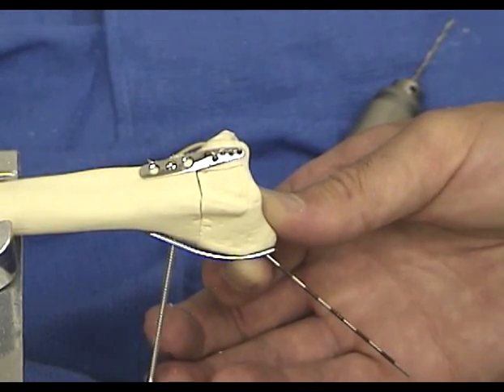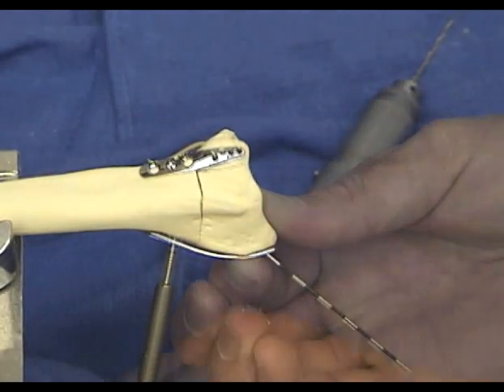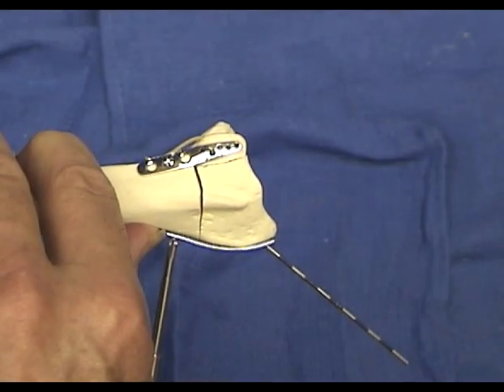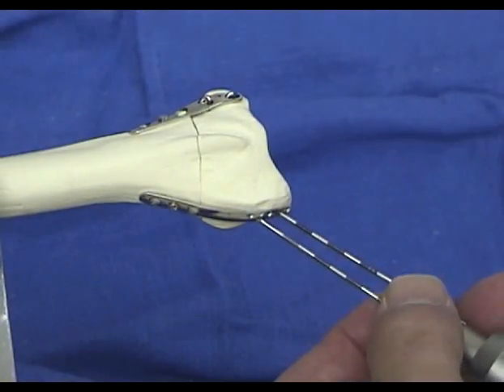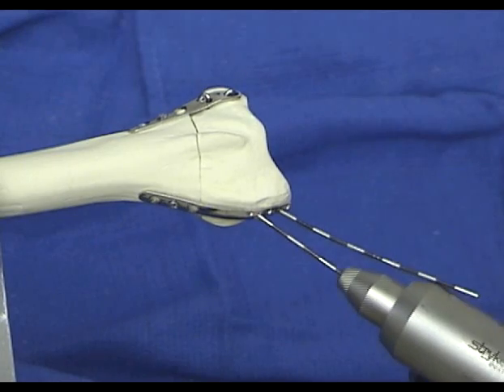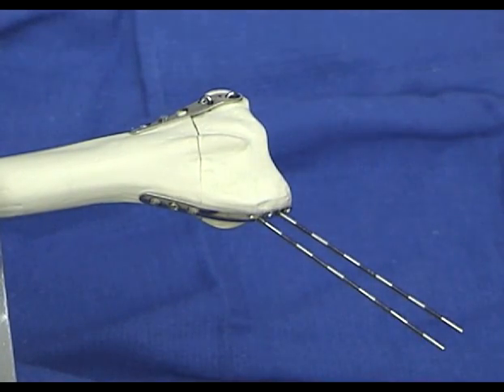As the bone screw is secured, the plate flattens, pushing the radial column fragment towards the ulna. This produces load sharing between the fragments and adds to the stability of the fixation. The process is repeated with a second zebra wire, skipping one pin hole. Again, the drill sheath is used as a drill stop to limit the pin penetration to one to two millimeters through the ulnar cortex. This is confirmed with a C-arm and allows the mark to be noted indicating the correct final length.